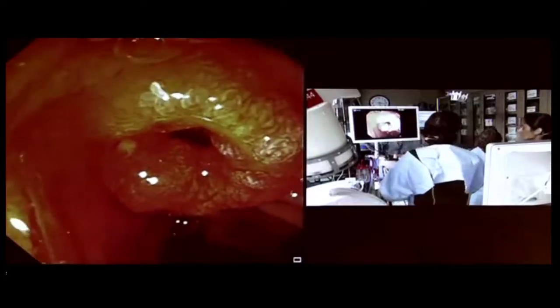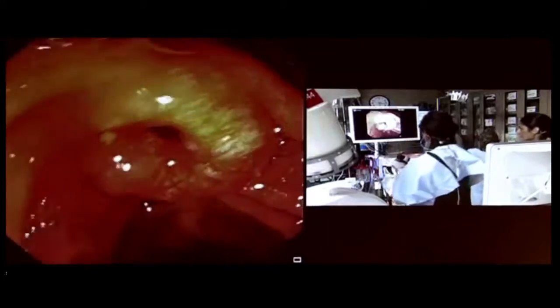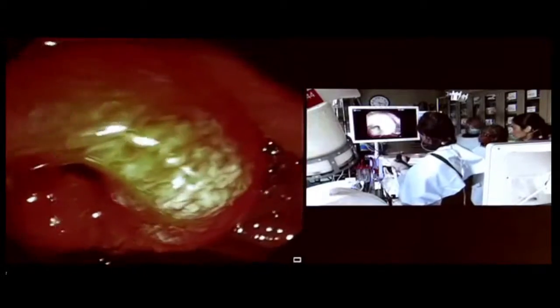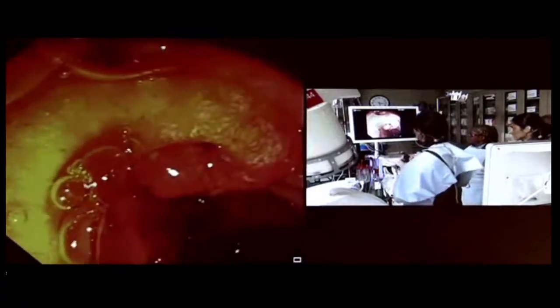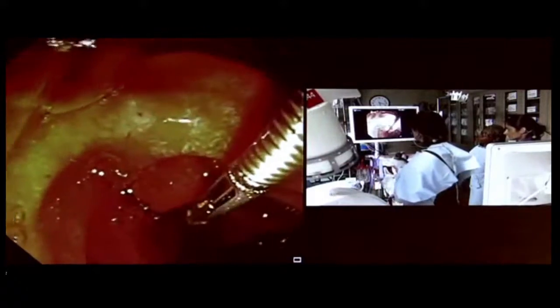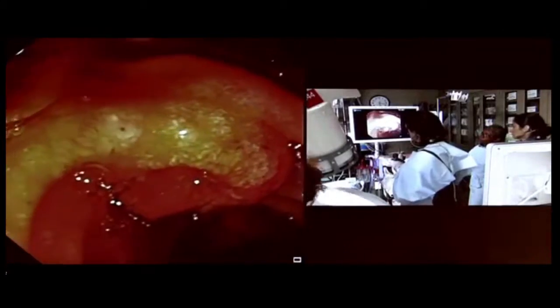This is a WallFlex, right? Yeah. The WallFlex is nice because it has this metal handle, if you will. I call it the basket handle, and this is what we can grab to pull this out. So even if the stent migrates up into the duct, you can put a rat tooth forceps into the duct, and you can grab that basket handle, and it'll collapse the stent very nicely. So let's open up the rat tooth now. I've already inserted that, and we're going to try to avoid grasping too much of the tissue.